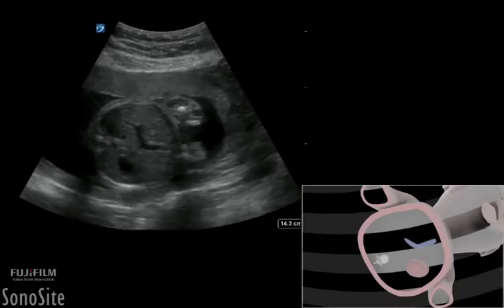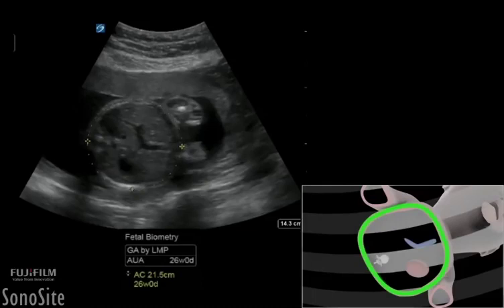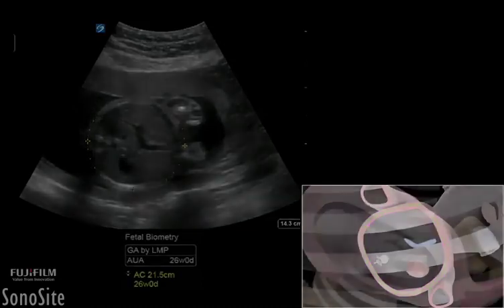The abdominal circumference measurement is used in late pregnancy to reflect fetal size and weight rather than age, and is done by placing calipers on the outer skin surface of the circular abdomen and employing the ellipse measurement feature.